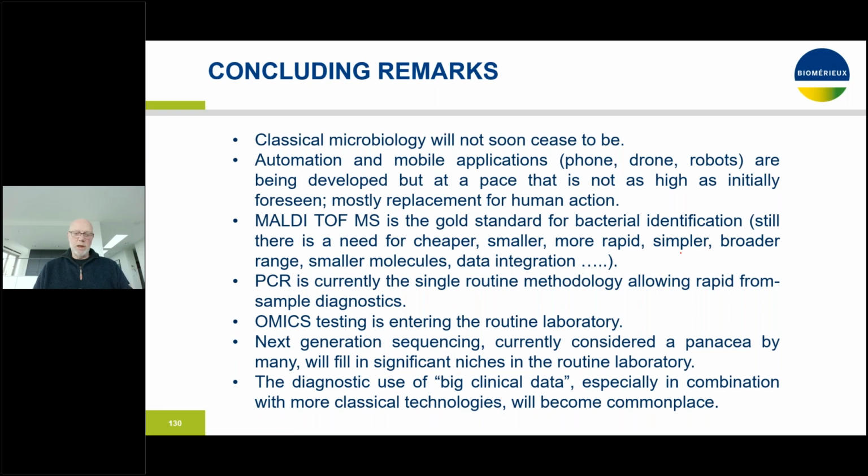PCR and sequencing and other omics technologies will enter the routine lab, but as a final word, I think that the more data we would be able to put into our predictive diagnostic modules, the better and the more clinically valuable these outcomes are going to be.